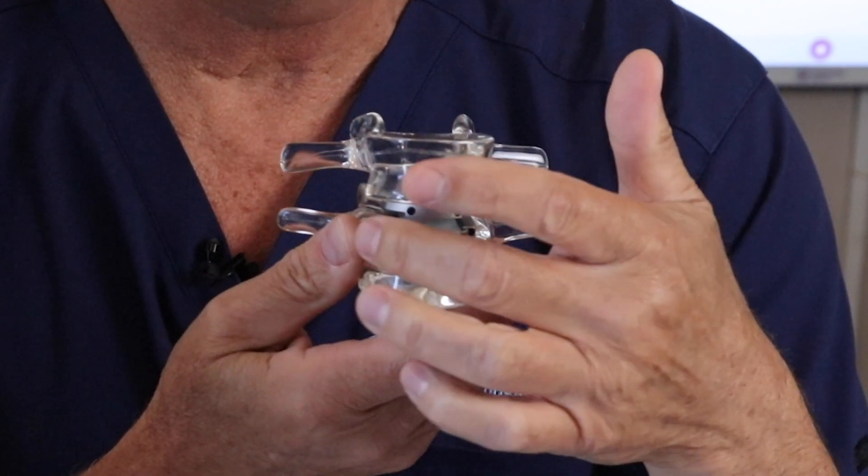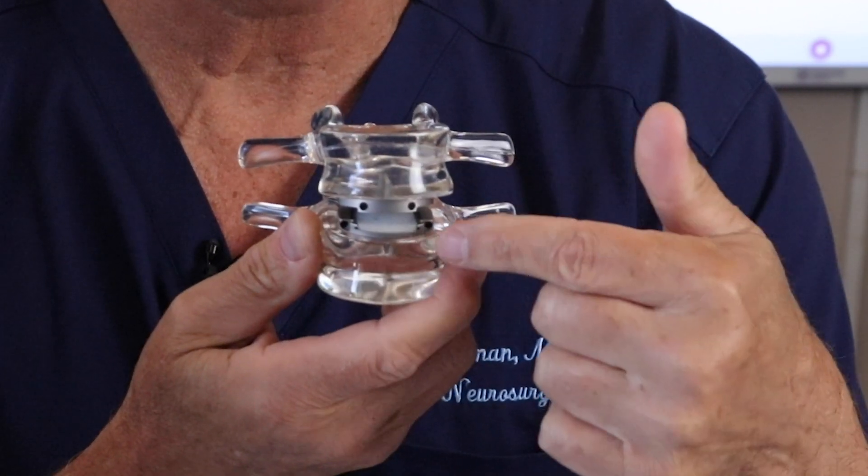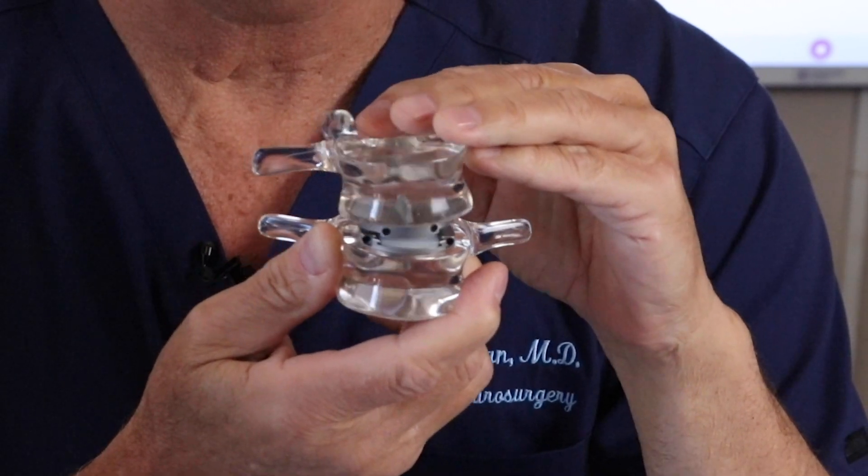How does an artificial disc replacement work? How does it work inside there? In an earlier video I mentioned what an artificial disc replacement is. This is a lumbar or low back artificial disc right here. It's one of the most common ones put in today. It's called ProDisc.